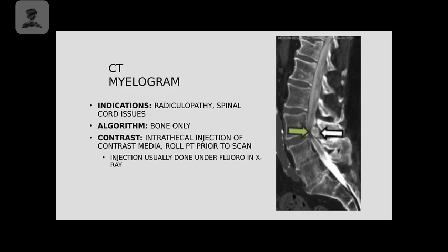X-ray usually is able to kind of compensate a little bit more for an exam like this, but their typical imaging is not enough for a full study, I guess you could say, to ensure that they don't have some type of stenosis or mass of some sort. So you can see that over here, the whole entire spinal canal is filled with contrast. It is not unusual for the base of the spine to have more contrast. It's very potent down there, so it's very bright because that's where it was injected to begin with.